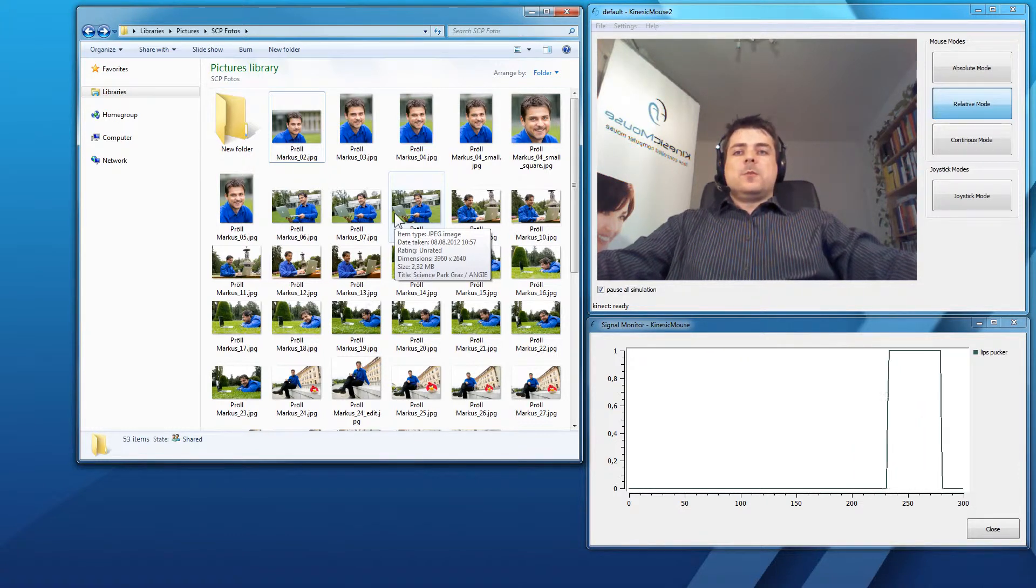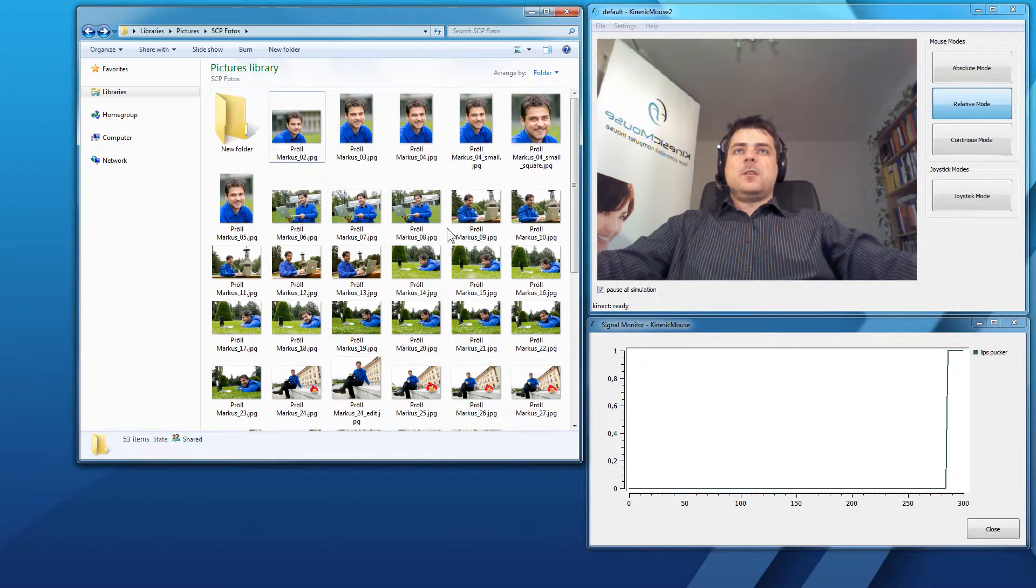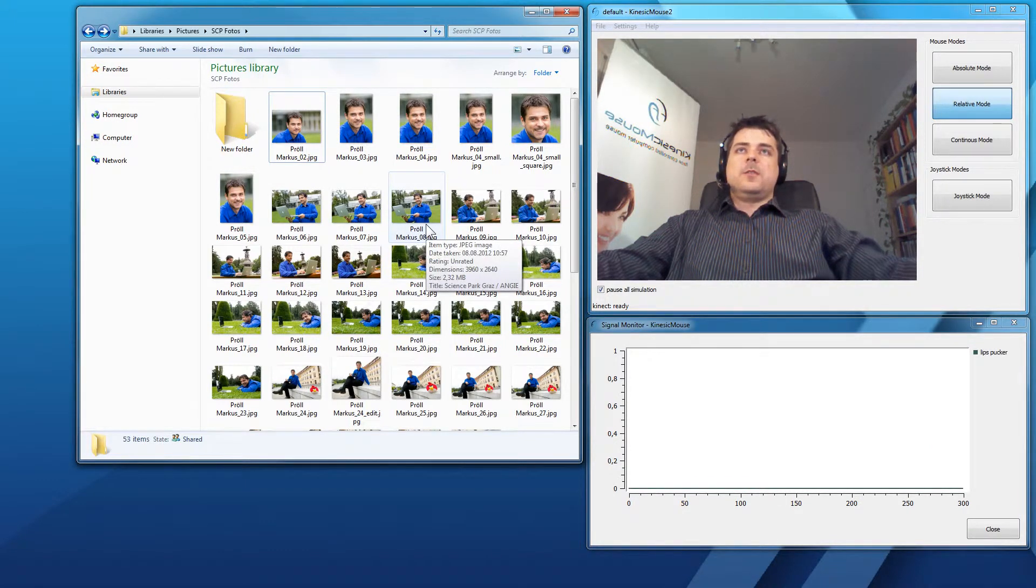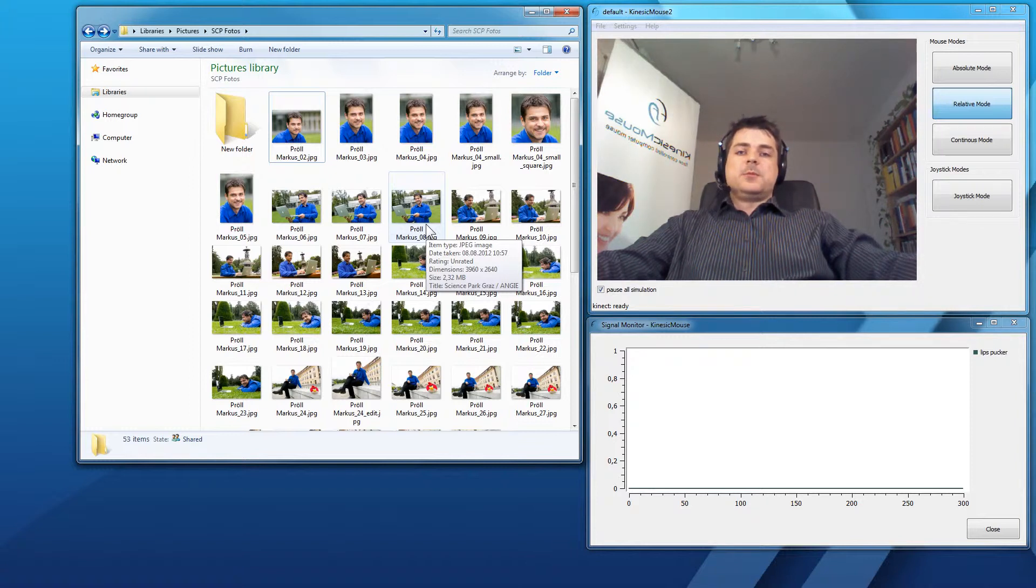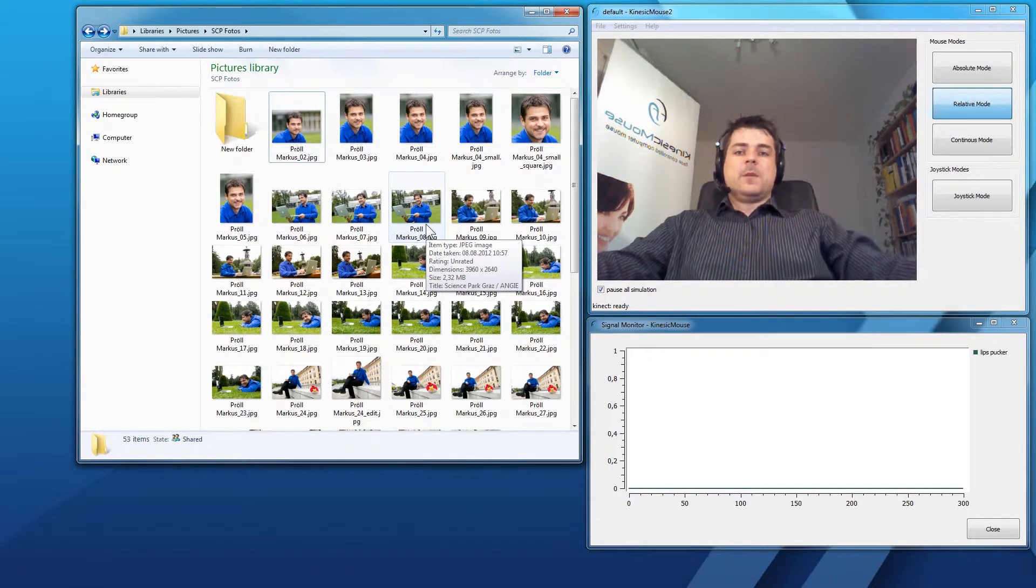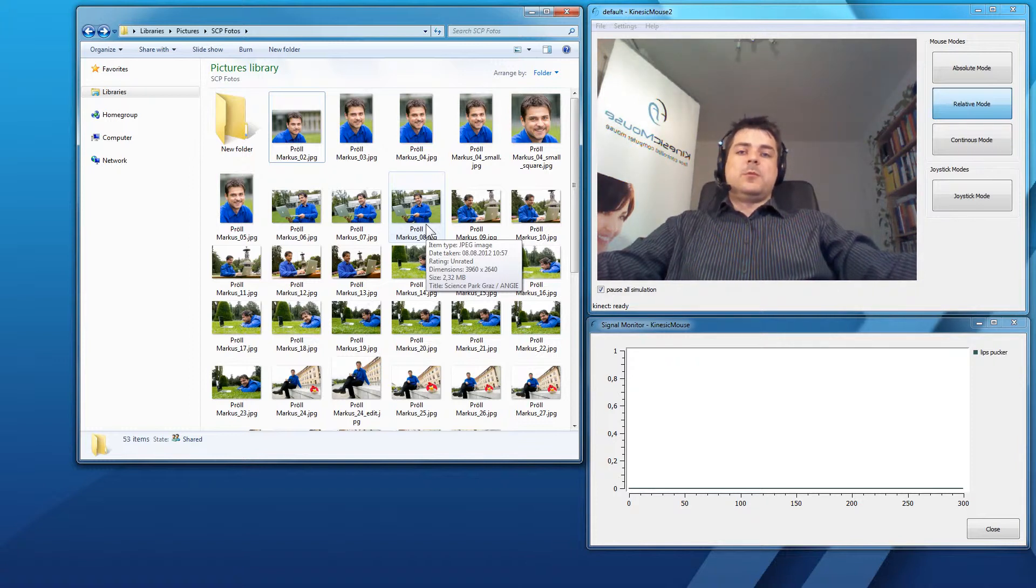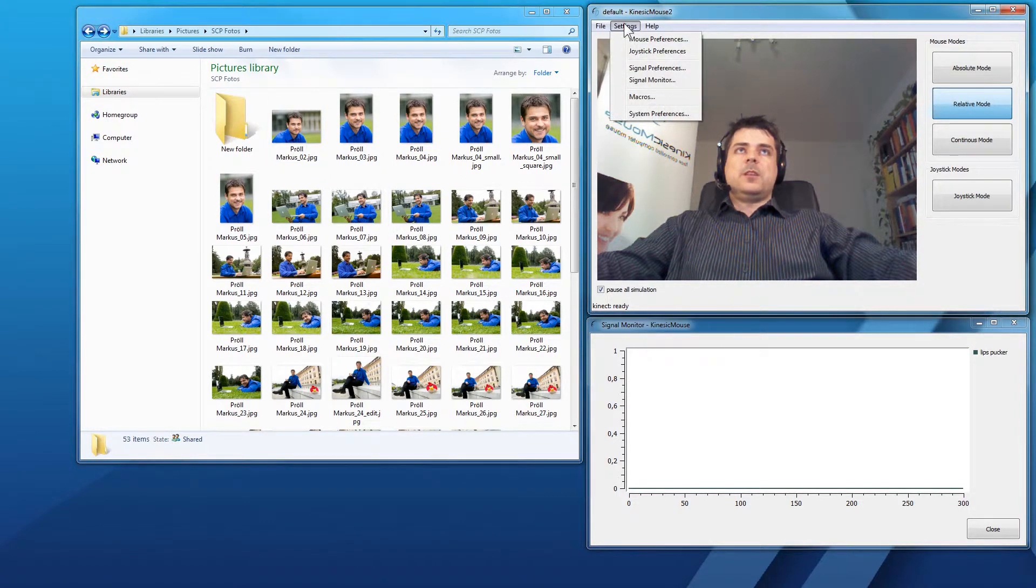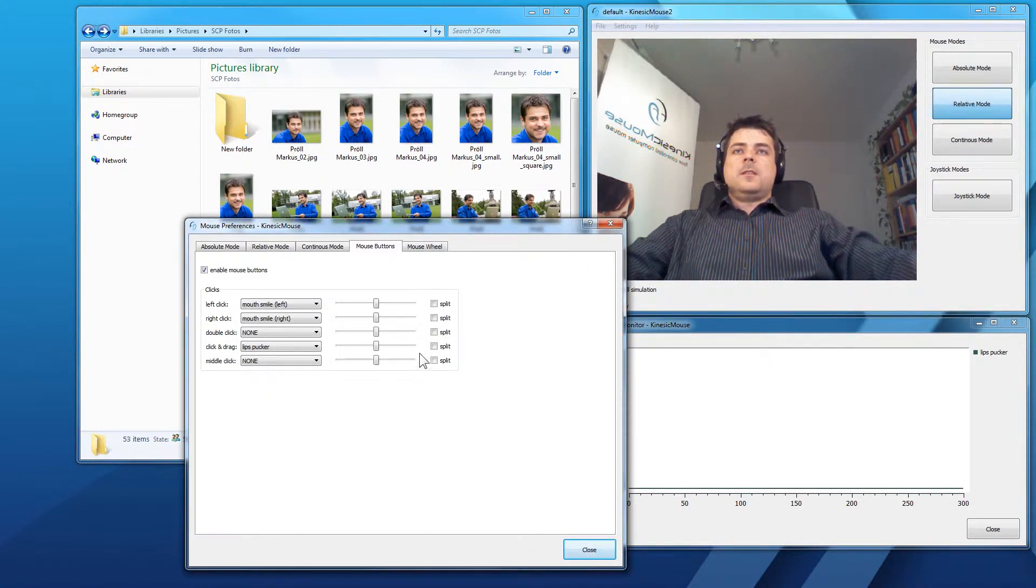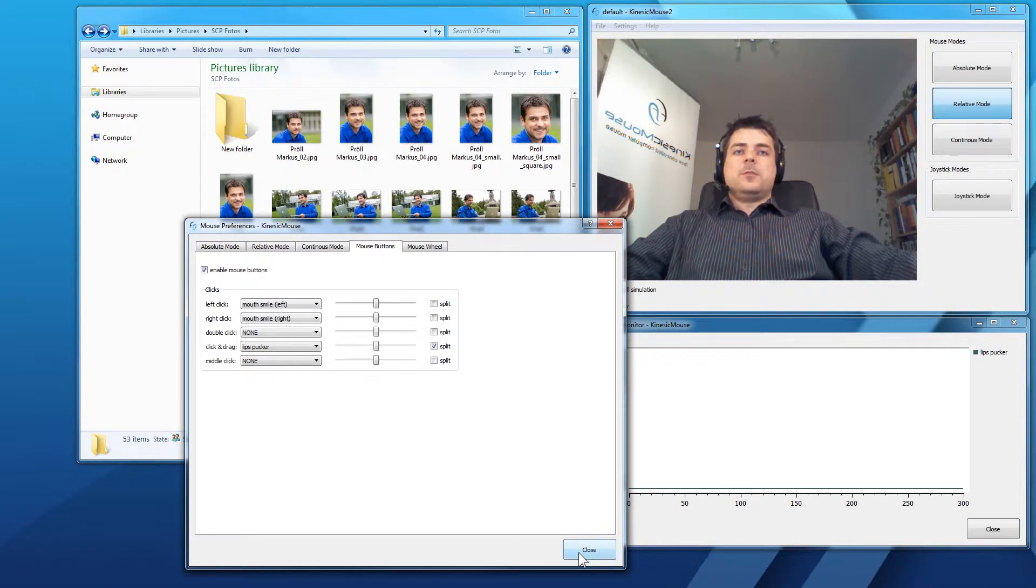So, if I'm not that confident with the lips pucking or I have to do it for a longer way, there is actually a second option where you have to perform the facial expression twice. One time to hold down the mouse button and the second time to release it. If you want this, you can go to settings, mouse preferences and set the split checkmark here at the click and drag.